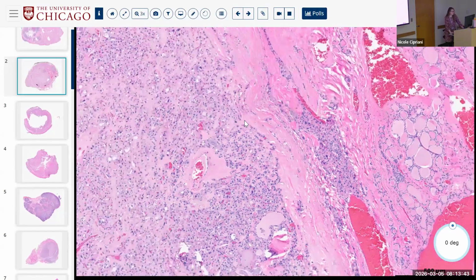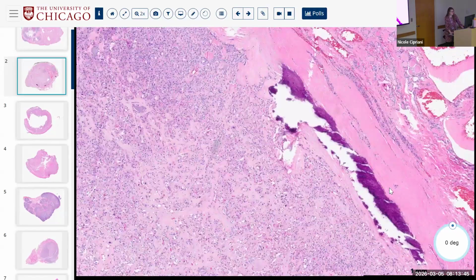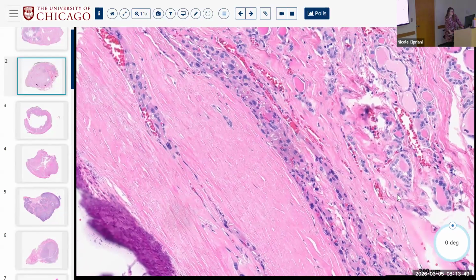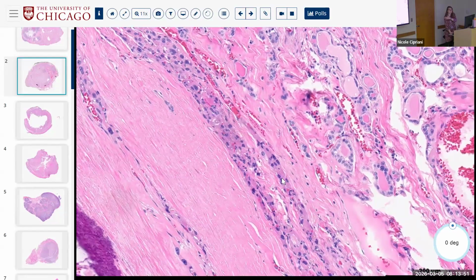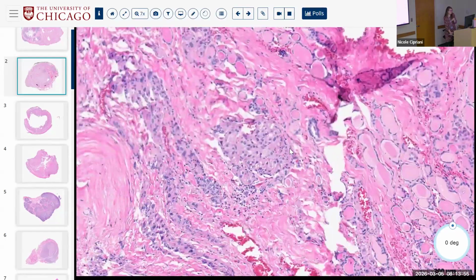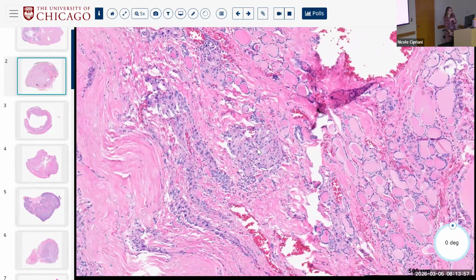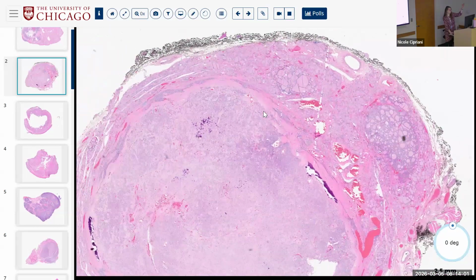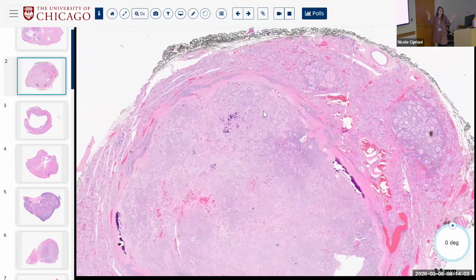And if so, then you can make a diagnosis of malignancy. In many cases, you have these trickling, streaming cords of cells present on the other side of the capsule. So yes, we would agree there's another one right there. All right, so this is again another slightly more subtle example. So what's your line diagnosis?